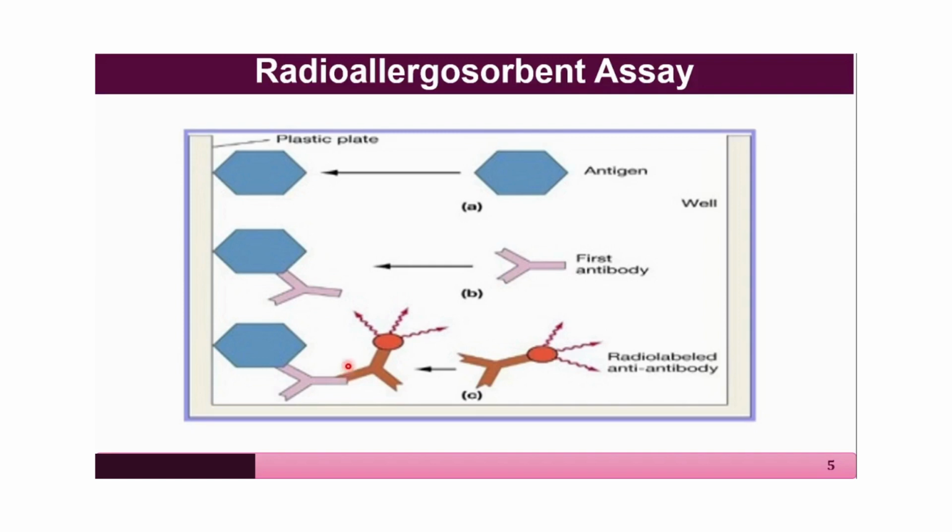From this, one can identify which allergens are capable of causing the allergic reaction in that patient. Therefore, he has produced IgE antibodies in his serum. Those allergens can be classified and the patient can be advised to avoid them to decrease the concentration of IgE in his blood, so that his constant suffering from allergy can be avoided.